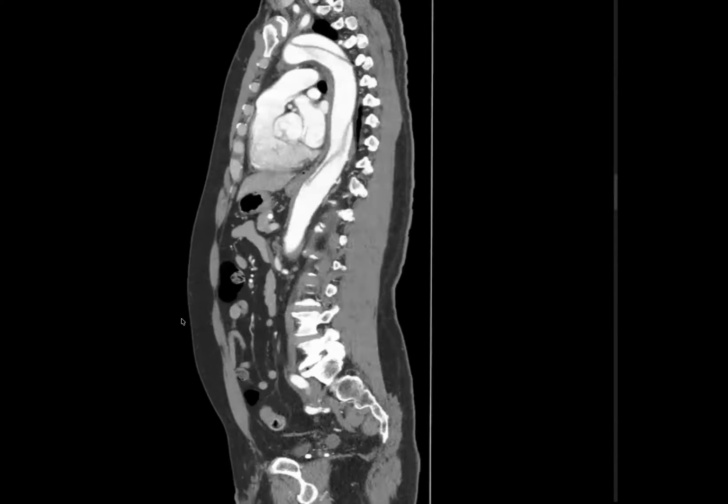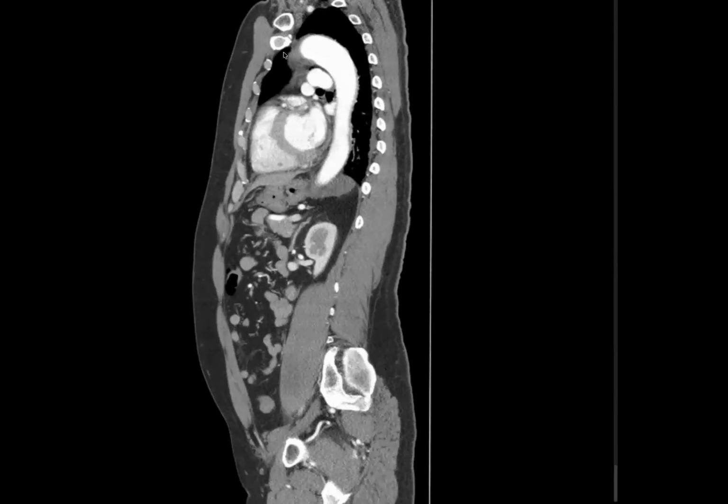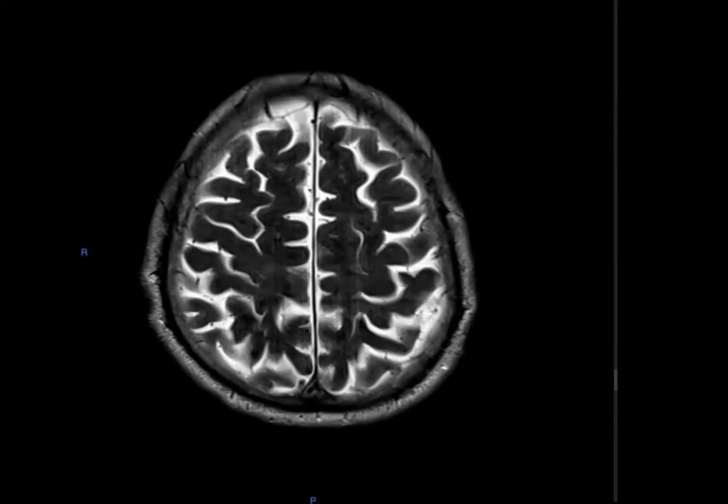And this is fine. You handled everything well here. You discussed the management and appropriately flagged this as an emergency. Just don't forget that when you're describing the emergency, make sure that the patient also gets help for their cord. So I will recommend a neurology review for their cord infarct as well. So this is a two-part case. So make sure you don't forget the first part. Okay. Yes.